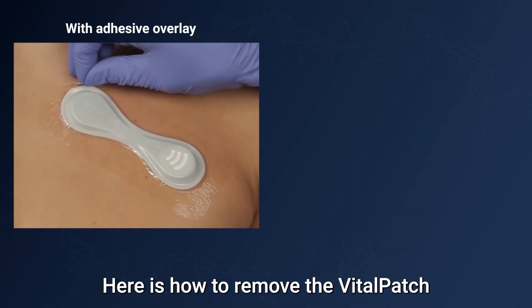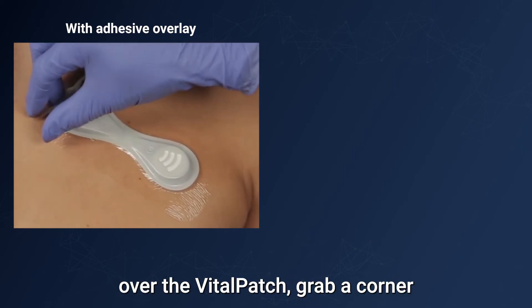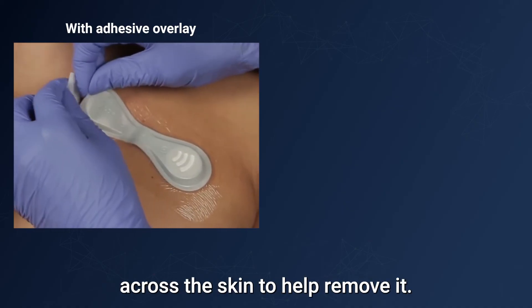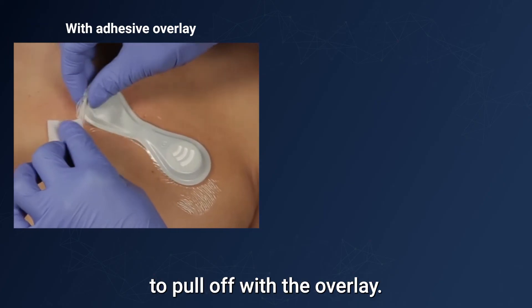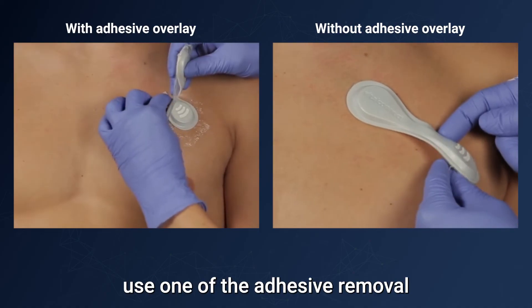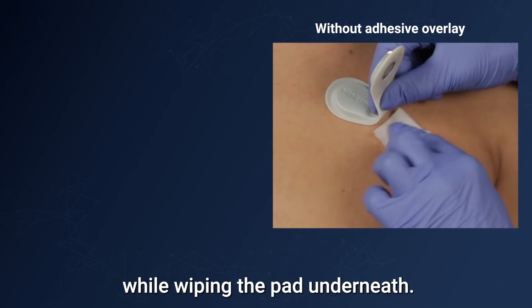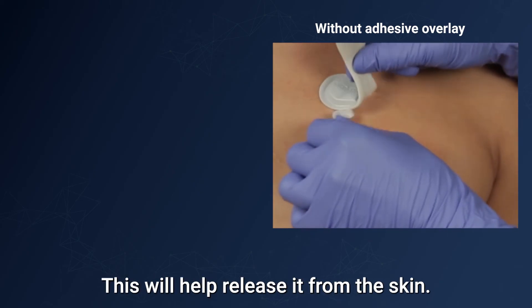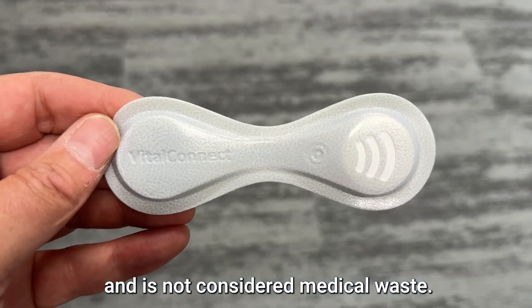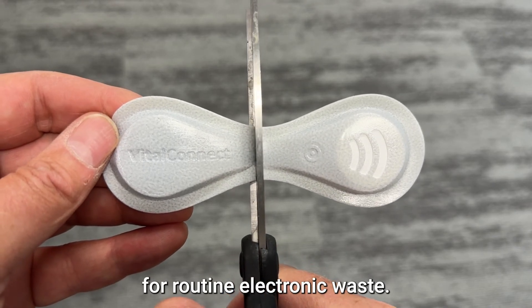Here is how to remove the Vital Patch after disconnecting. If you applied an adhesive overlay over the Vital Patch, grab a corner of the overlay and stretch it sideways across the skin to help remove it — the Vital Patch will begin to pull off with the overlay. If there is no overlay, use one of the adhesive removal pads provided with the kit. Pull up a corner of the Vital Patch while wiping the pad underneath to help release it from the skin. The Vital Patch is disposable and is not considered medical waste.